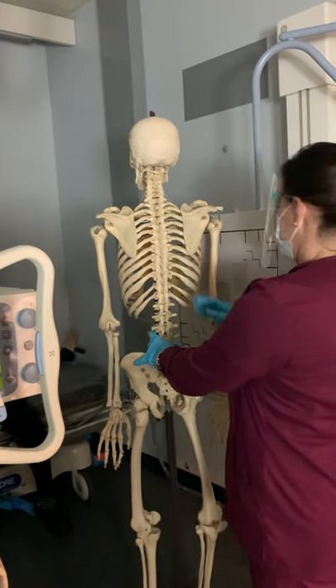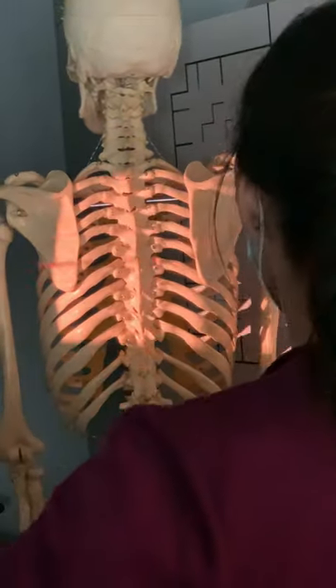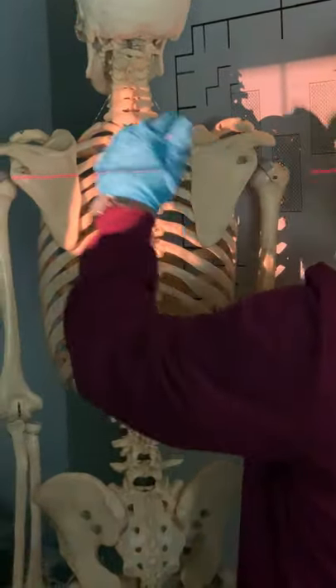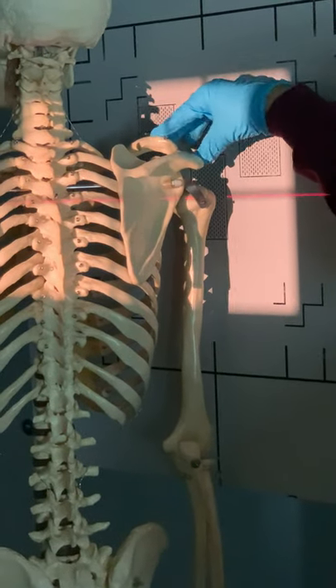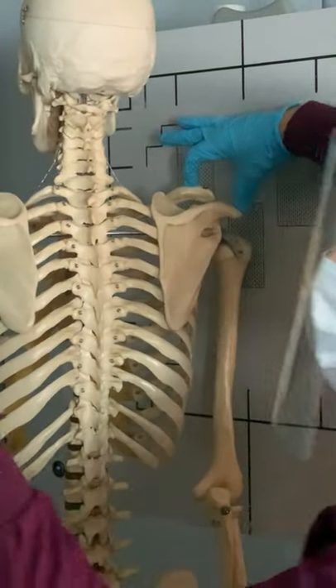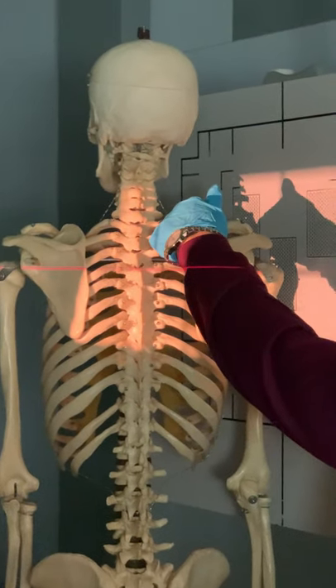I'm turning my patient so the scapula is going to be nice and lateral. It may not be exact, but it's good for you to see that the scapula is truly lateral. What I'm trying to do is take an image where the scapula is lateral, with my central ray coming through pretty much the AC joint. You're going to feel the acromion, feel the end of the clavicle, and use your hand — this line should be coming straight through it. If you stand straight in front, you'll see that the longitudinal line is coming through your hand.